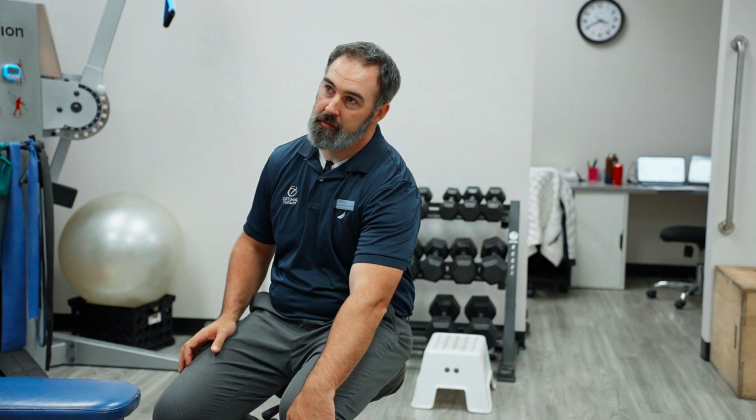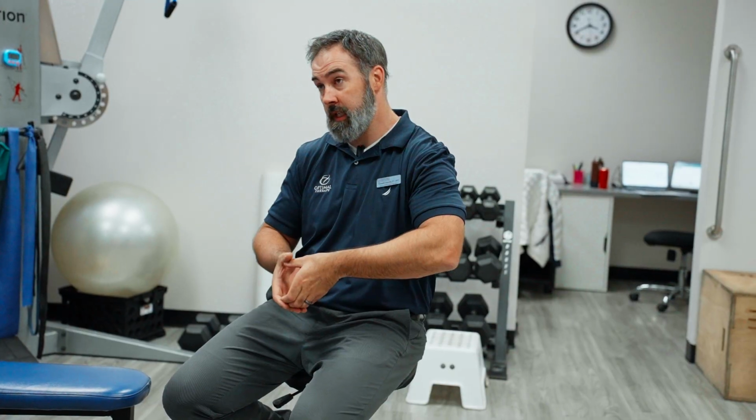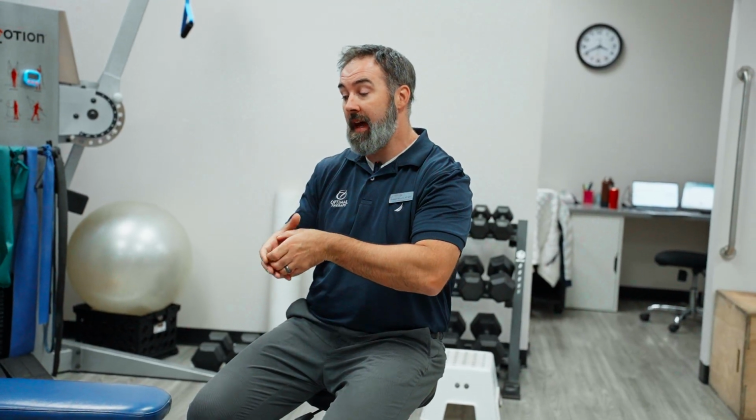Your symptoms seem to be a little more of what's called a peritendinitis, which is there's a sheath that covers the tendon. That seems to be what's inflamed versus the actual tendon being inflamed. And so the shockwave getting there could be breaking up adhesions along the peritendon, which helps free it up and make it move a little more naturally and allow the tendon to move a little more naturally underneath it, which could cause some of that reduction in pain, but it's probably mostly due to endorphins.